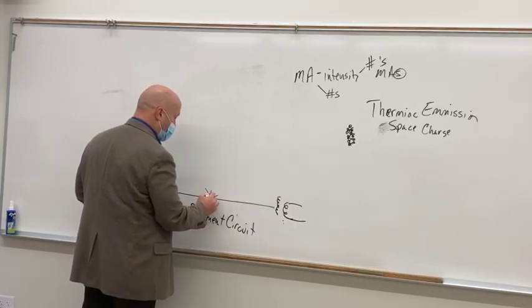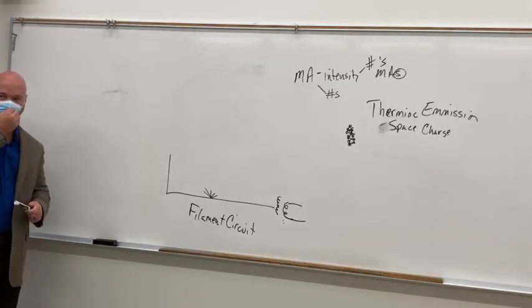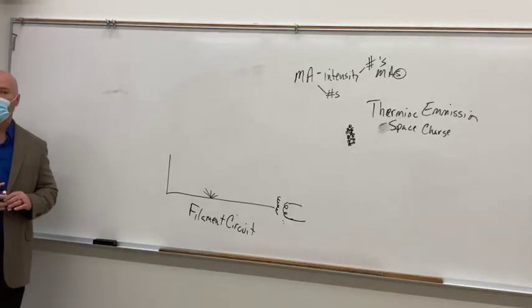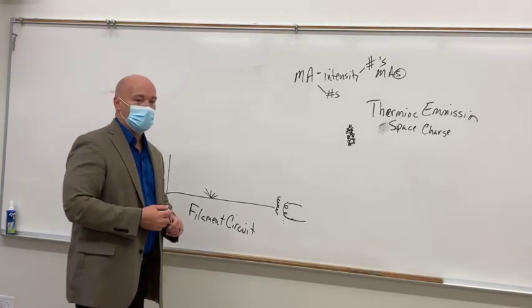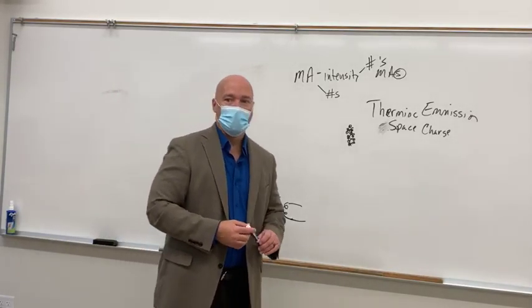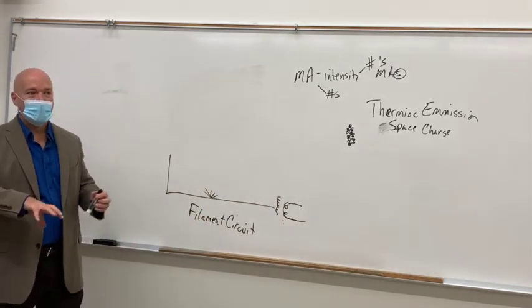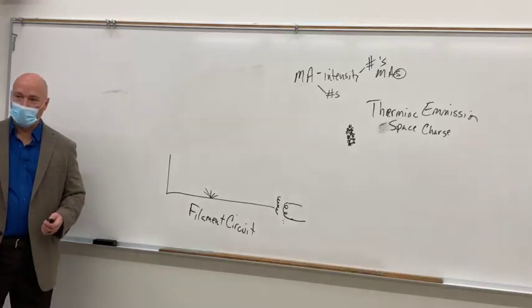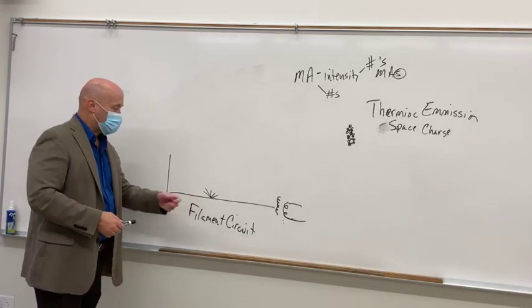All right, so what do we call the auto transformer? What do we call it? A rheostat. Yeah, what is a rheostat? Changes it up and down. You can increase or decrease whatever you're using. Voltage, amperage, power, whatever. It turns it up and down. So this is MA selector.